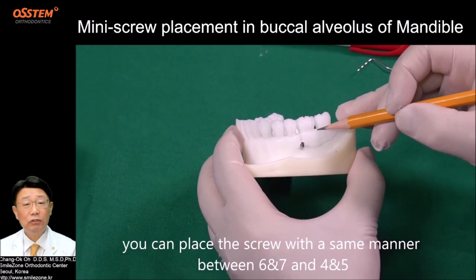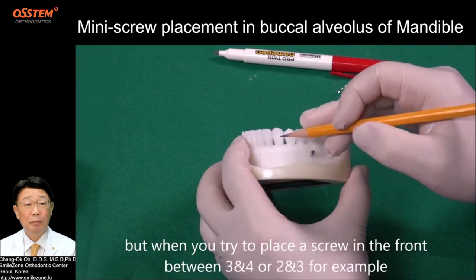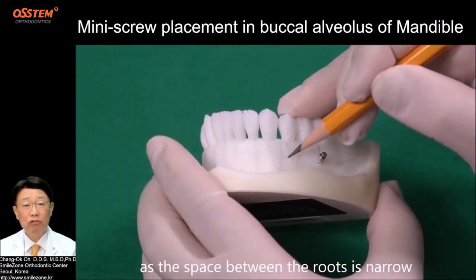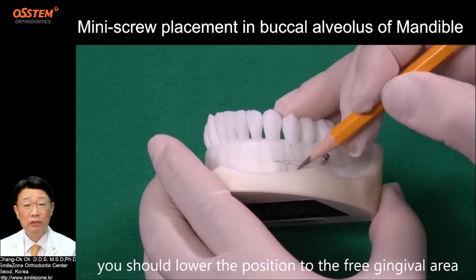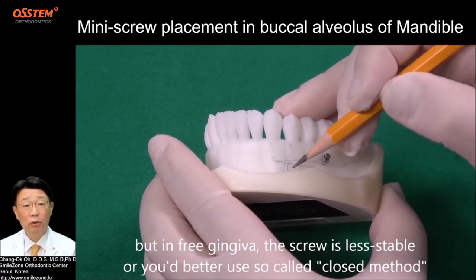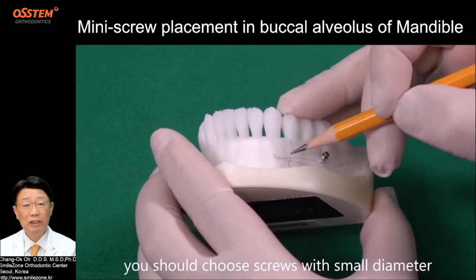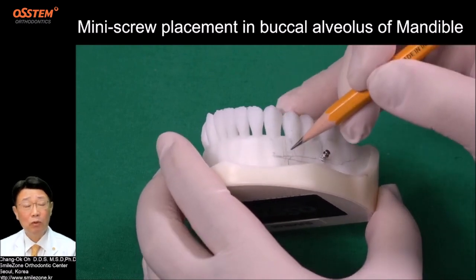You can place the screw in the same manner between teeth 6 and 7, or 4 and 5. However, when placing a screw in the front — between 3 and 4 or 2 and 3 — the space between the roots is narrow, so you should lower the position into the free gingiva area. In the free gingiva the screw is less stable; you would be better to use the so-called closed method. Otherwise, to place in attached gingiva, you should choose screws with a small diameter.